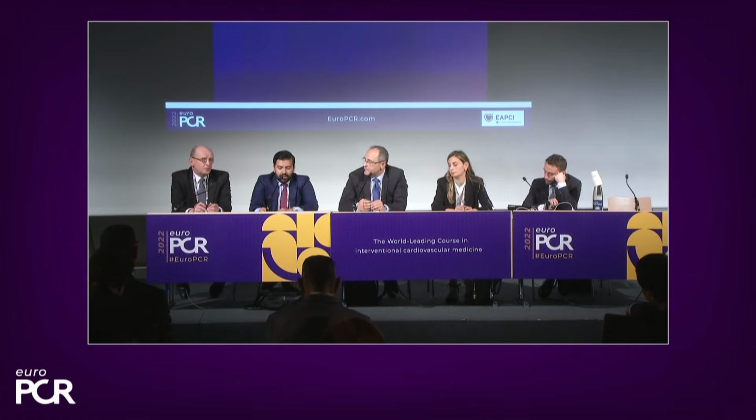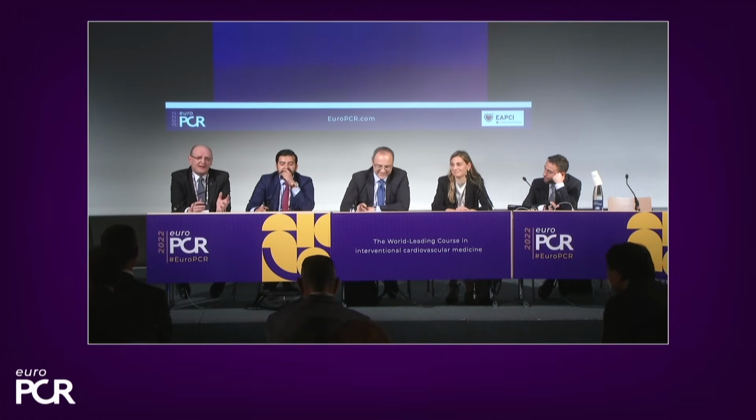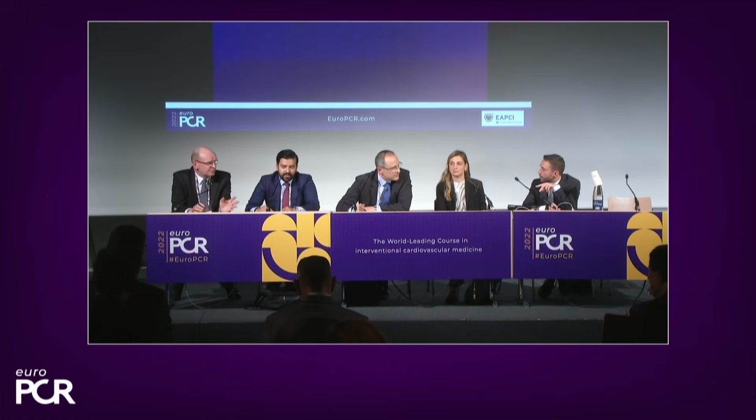Well, we have to remind ourselves of what we learned 10 years ago, before stents. Longer than that, isn't it? 20 years. When I had hair. You can leave dissection as long as flow is good, and you're patient. You have to watch it for a while. You can't just take one picture and then pull the sheath. You have to wait, and you have to be sure that the flow is good, and then you make your decision.